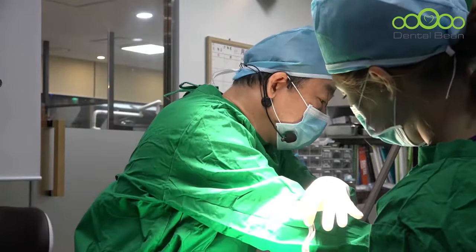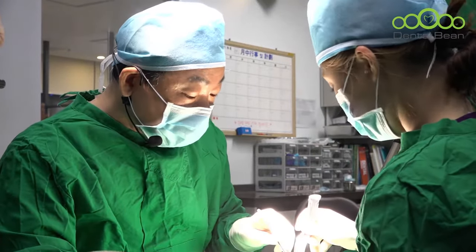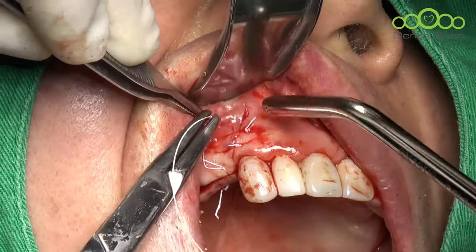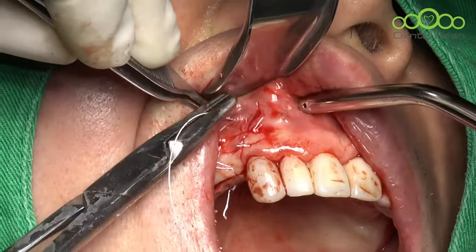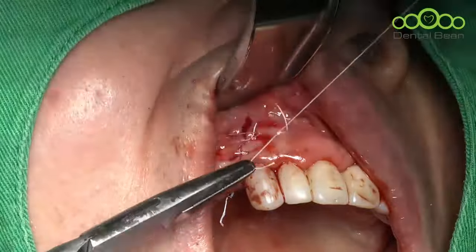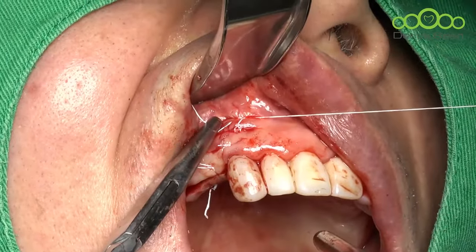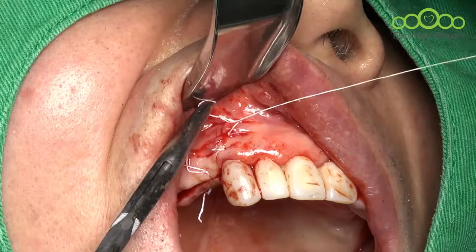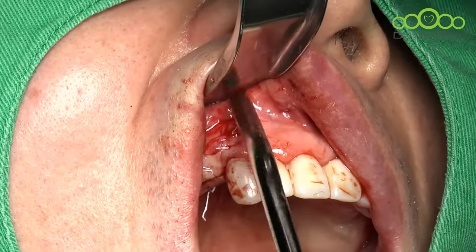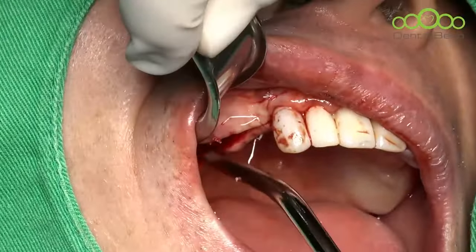I performed a modified ridge splitting. I named this one combination splitting. I followed just the crestal osteotomy without vertical osteotomy, but I used a chisel to enlarge the bone width. So there's no perfect method, no single comfortable and effective way. Every technique has advantages and disadvantages. So depending on the situation, you can use the most effective way. I focused on widening the ridge, and also on no fracturing. That's why I combined the techniques.